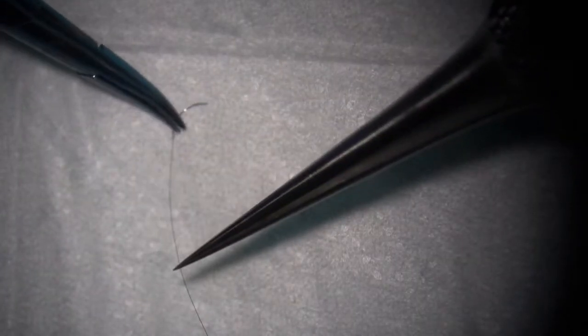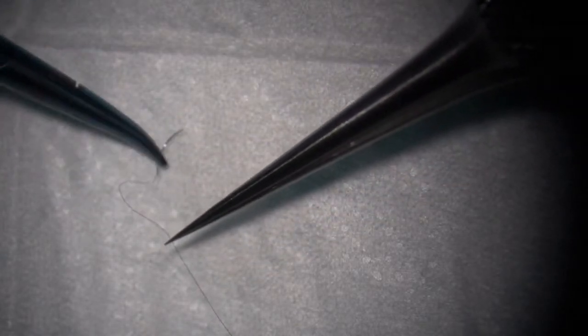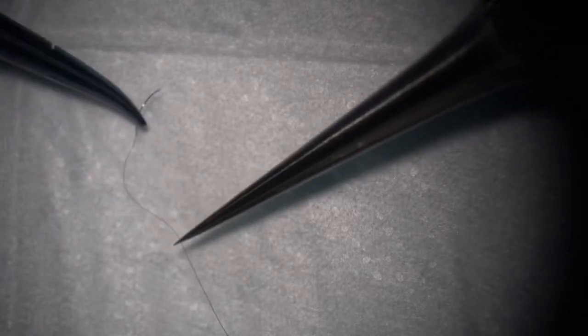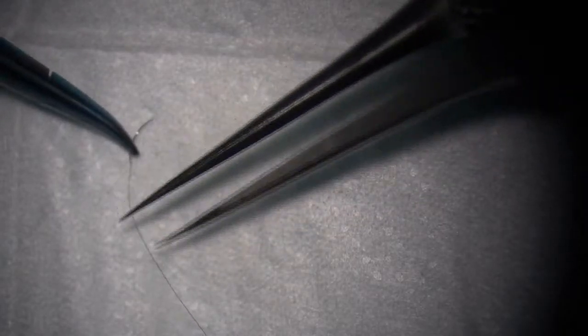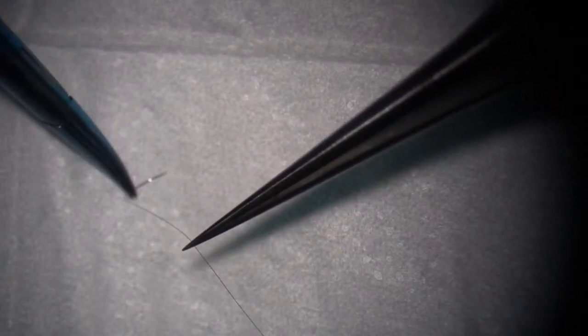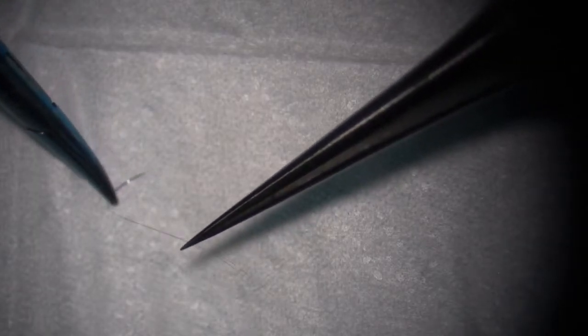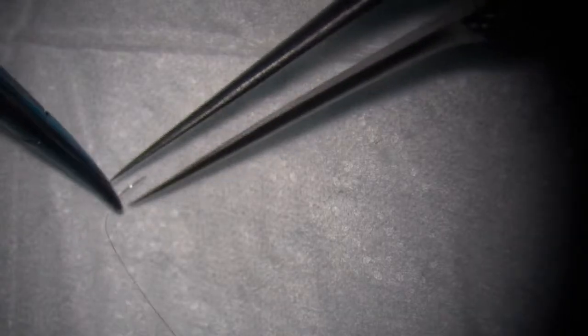Right? We don't hold it too close to here, because now you can only move 1 millimeter. If we hold it here, we have 1 centimeter to move. That's the way when we braid the suture. Yeah, so we dangle the needle, and then touch the surface to stabilize it and then catch it. And rotate. Sometimes we can use one arm to push a little bit, making it kind of perpendicular to the needle holder. That's the stable way. Sometimes we pivot a little bit if the vessel didn't line up very well in front of us.